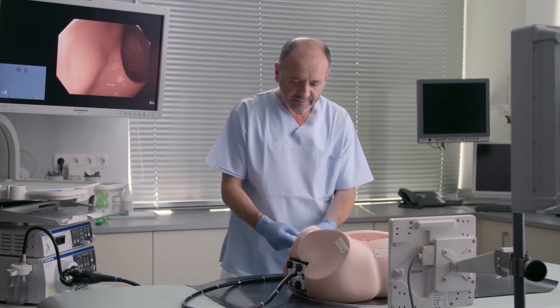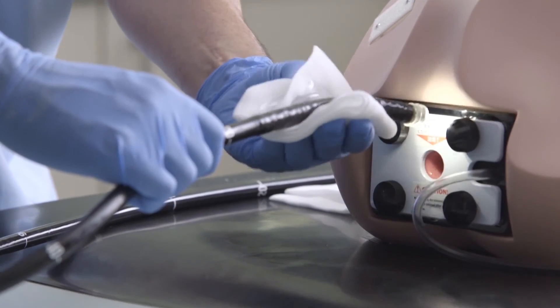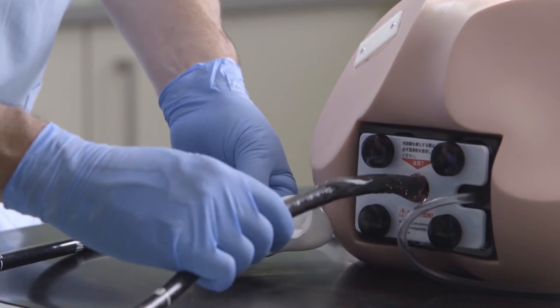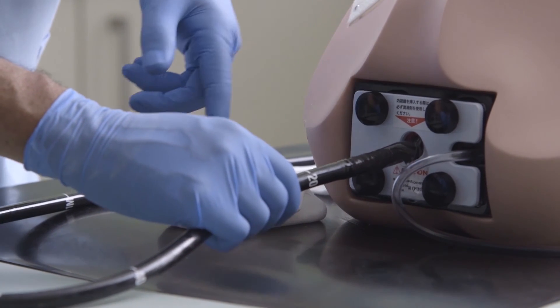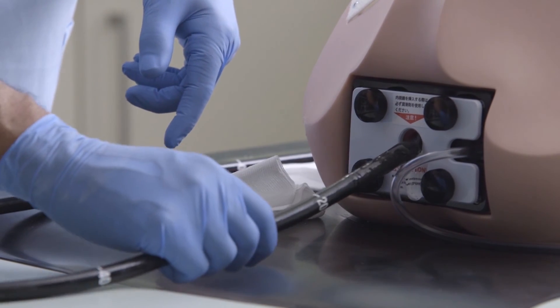One crucial step in colonoscopy is to really lubricate the endoscope. It has to be really well lubricated because there shouldn't be any friction — or as little friction as possible — at the anus, so that you can feel inside the colon.